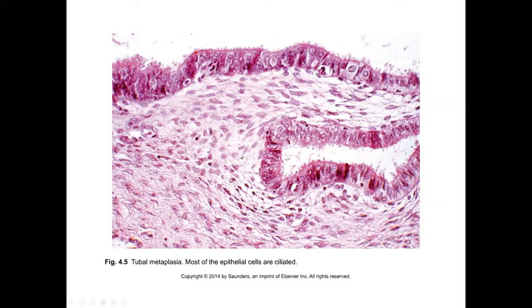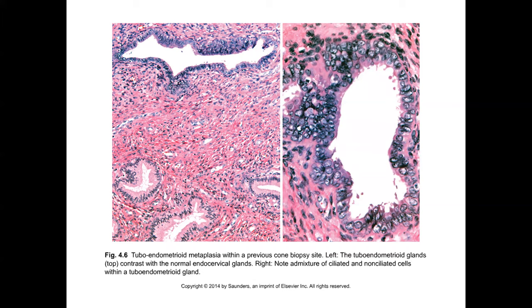Here's a combination of tubal and endometrioid-type change, where you'll get some ciliated cells and other areas without cilia that just look more endometrioid, without the typical endocervical-type epithelium.